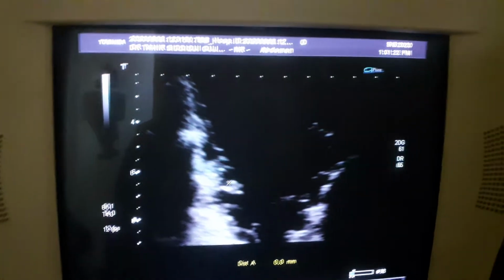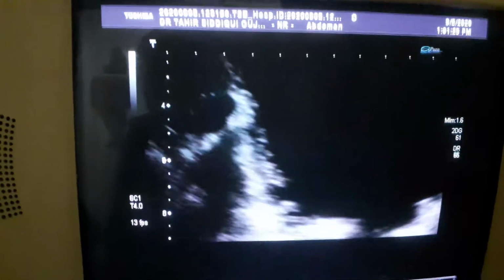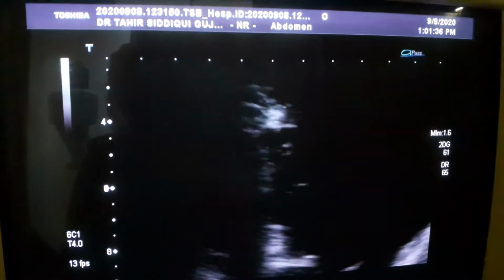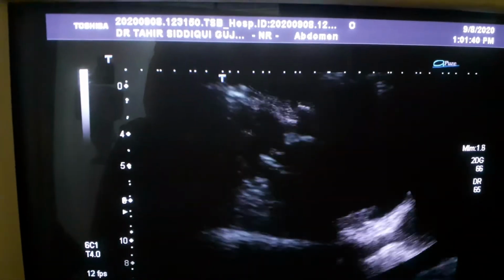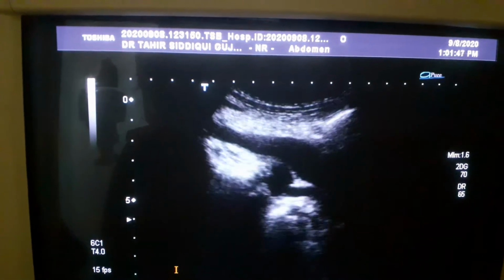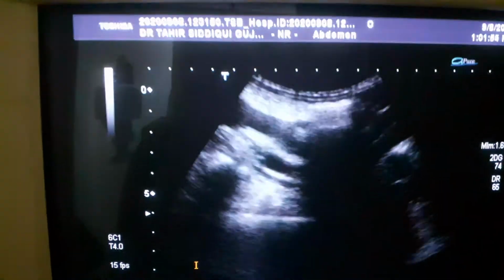Because of this hypertrophic trabeculation, you see it's on both sides, and it's involving both UVJ. And when we see the ureter, now I'm going to show the distal part of the right ureter. Dilated it is.